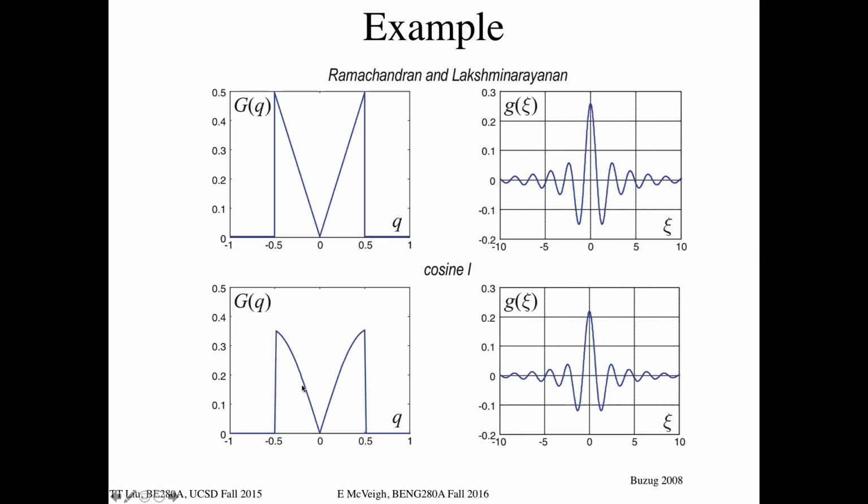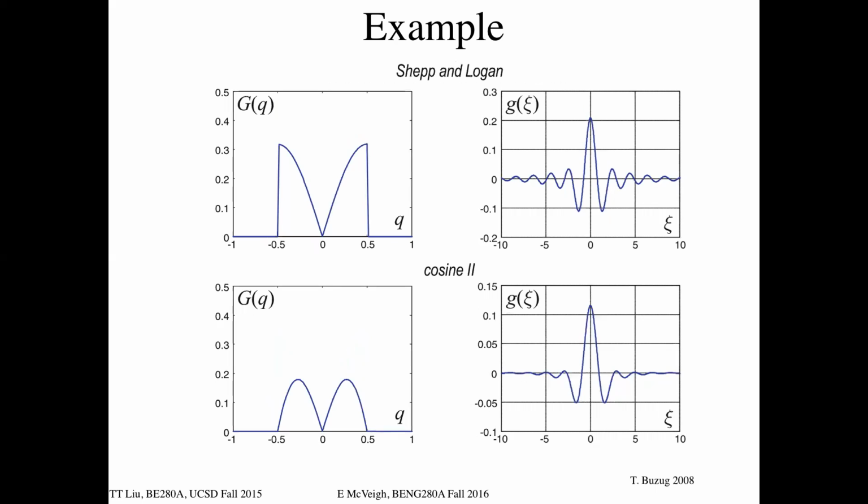That was the fundamental difference between doing the raw back projection of G L theta versus G star L theta, taking the DC out. And then if you want to make it even smoother, you can do something like this, where we still have the key part where DC goes down to 0 here, but then at the higher frequencies we're going to suppress those frequencies such that the image comes out more averaged and smoothed over space.